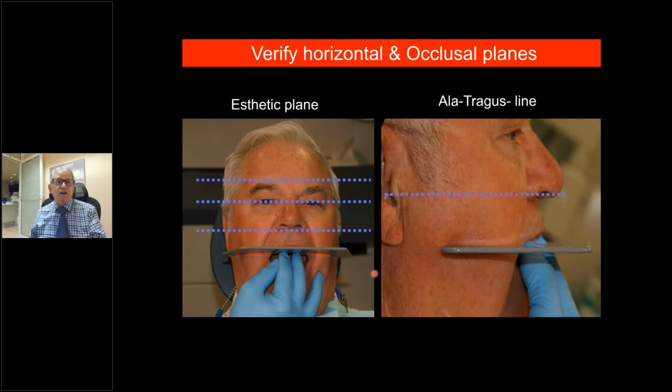Now it's time to do our Fox plane. We did the occlusal rim, we put it in, we actually went through the phonetics. Remember, we went through 50, 51, 52, 53, saying the F's, father, 55, 56, any F sounds, and you just want the occlusal rim to touch here, or if you're at the try-in stage, the anterior teeth edge, barely, father, 55.